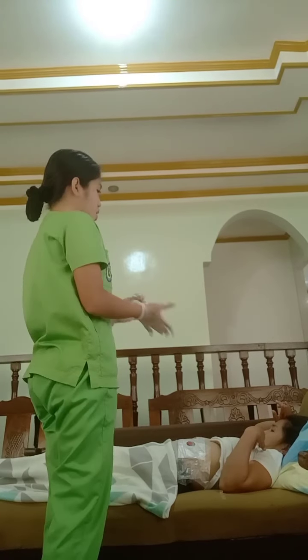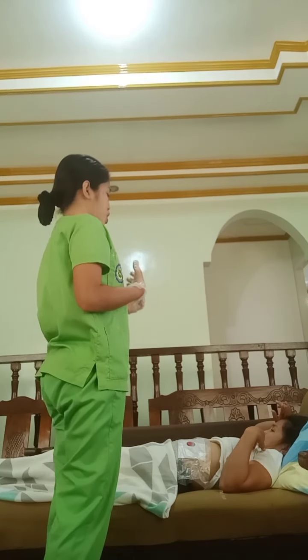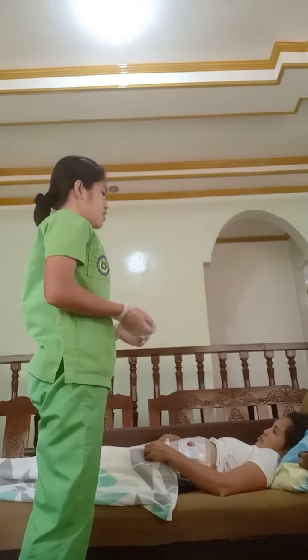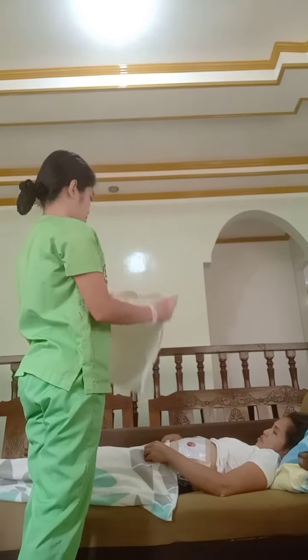And then next, now after we have already put on our clean gloves, we must help the patient assume the position of comfort, which is the side lying position. And then we must now provide a drape onto the side of the client. This is to prevent soiling the linen.